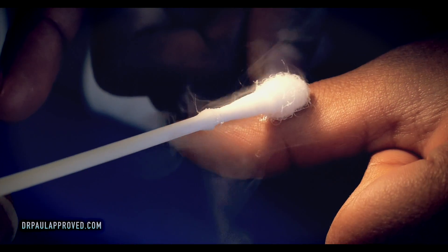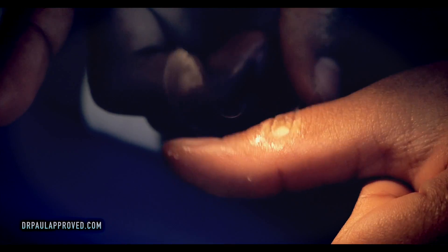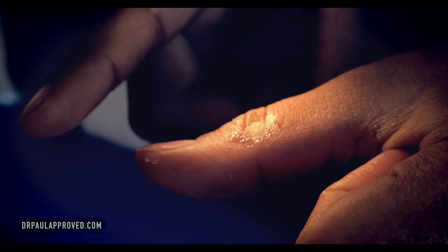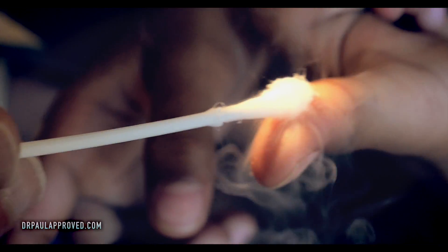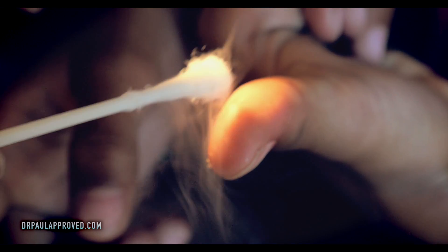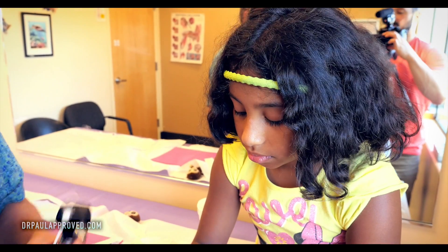So when we freeze these warts, half the time they just go away — they kind of shrink away over about a month. Oh, I have another one. Where's the other one? Behind here. I don't think that one would need anything. Because when your blood interacts with the virus, it'll take care of other ones as well, because it gets your immune system going.